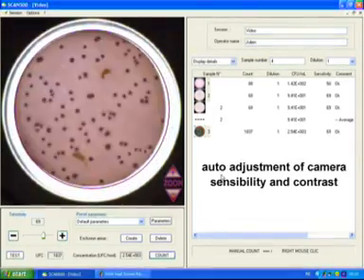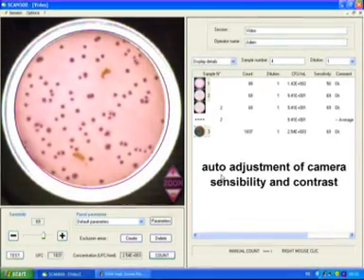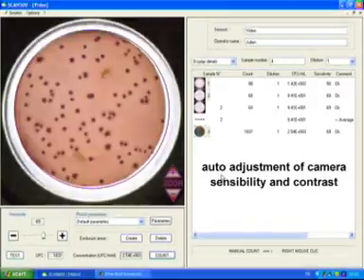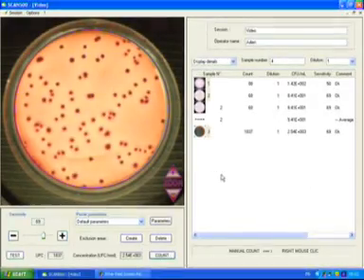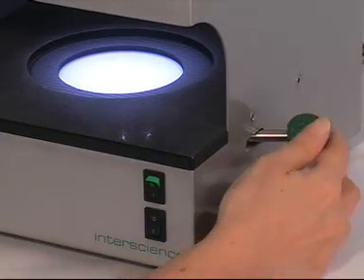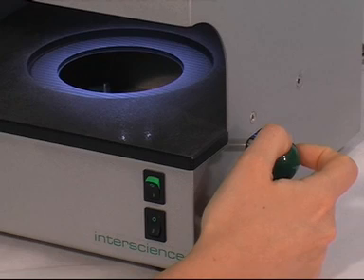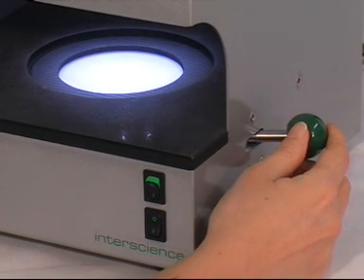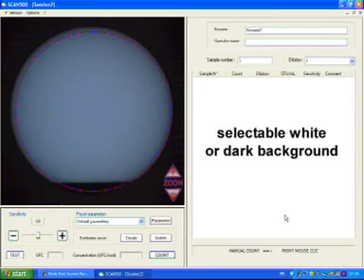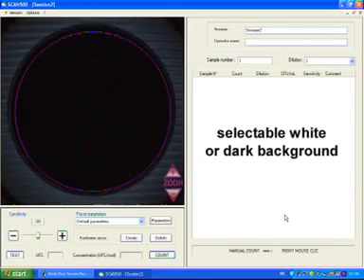Sensibility and contrast are automatically settled by the software. Depending on the consistency of your agar, choose between the light or dark background.